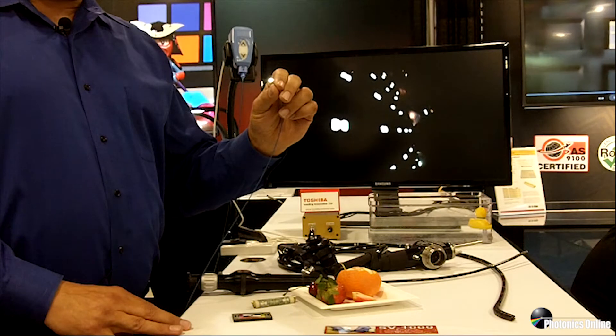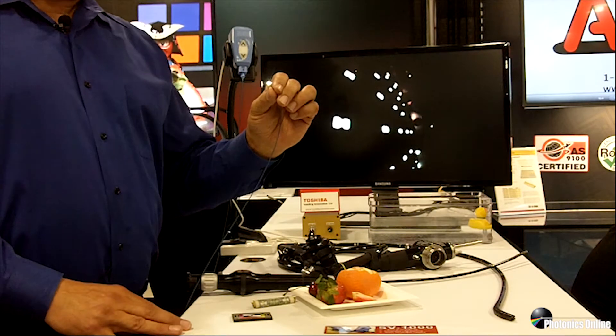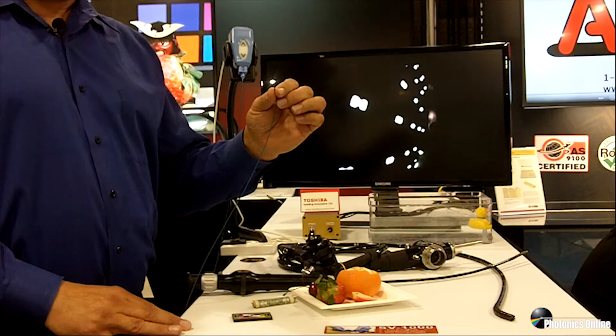The SV-1000 is our latest chip-on-tip technology camera. The sensor and lens are in the tip of this camera. It also includes LED illumination brought to the tip through fiber optics.